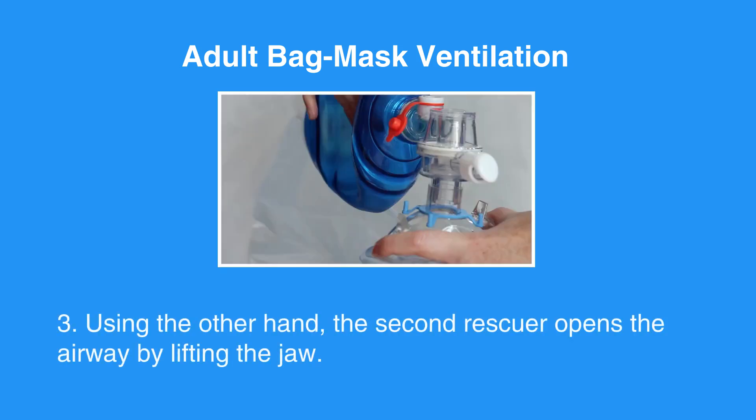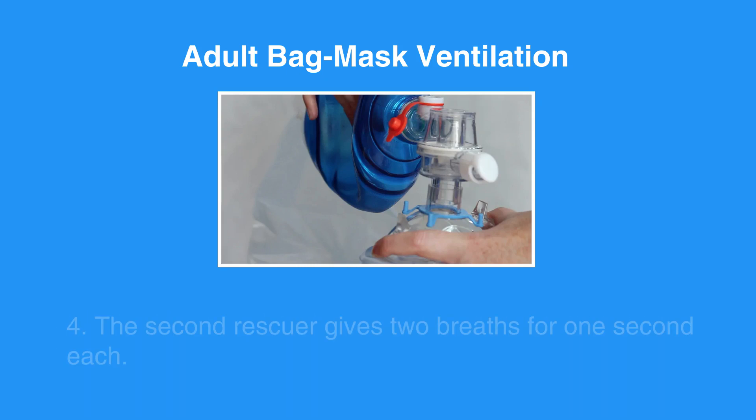Using the other hand, the second rescuer opens the airway by lifting the jaw. The second rescuer gives two breaths for one second each.